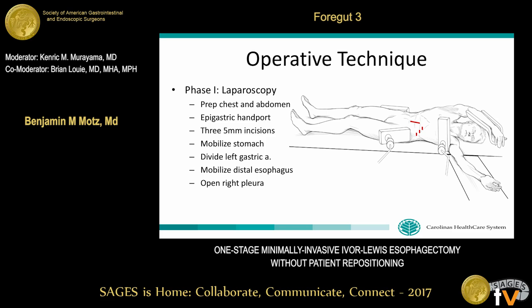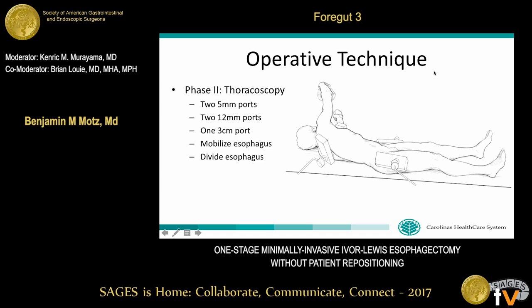The operation begins with a small epigastric hand port incision through which we extract the specimen and assist in retraction during dissection of the stomach. We then make three five-millimeter incisions along the left subcostal margin and proceed with laparoscopic mobilization of the stomach. We identify the left gastric artery, skeletonize it, and divide it using an endoscopic vascular stapler. We then mobilize the distal esophagus up into the mediastinum and intentionally open the right pleura before proceeding to the thoracoscopic portion.